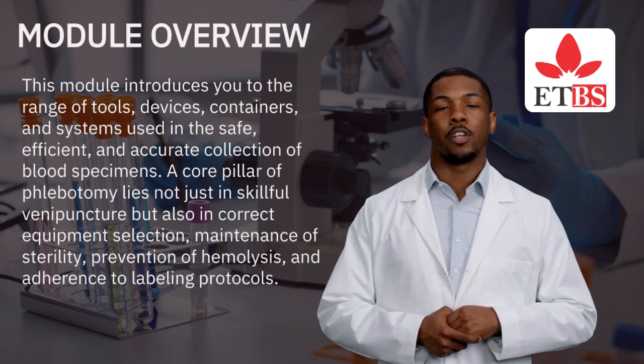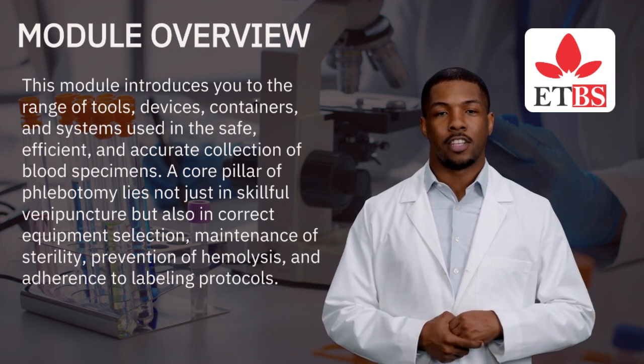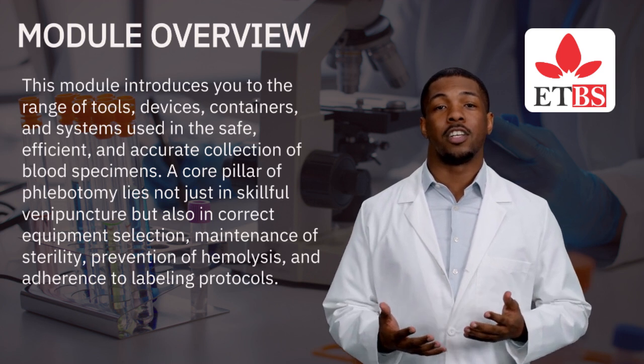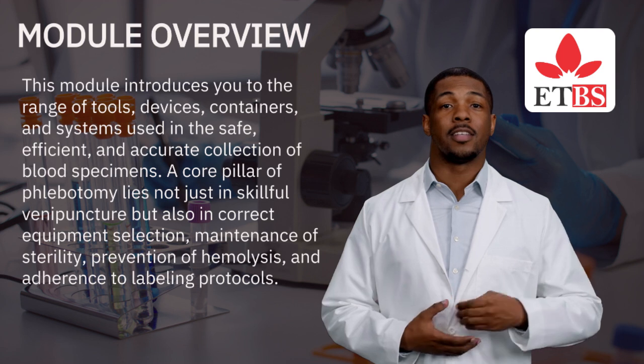Professionally trained phlebotomists must recognize and choose the appropriate equipment based on patient demographics, e.g., pediatric, geriatric, vein conditions, test requirements, e.g., coagulation versus chemistry, and procedural constraints, e.g., multiple draws, stat tests.